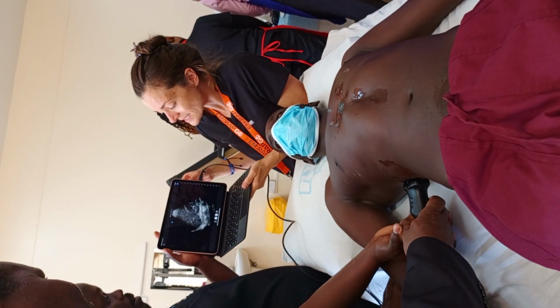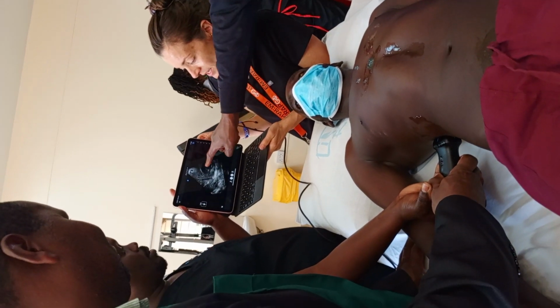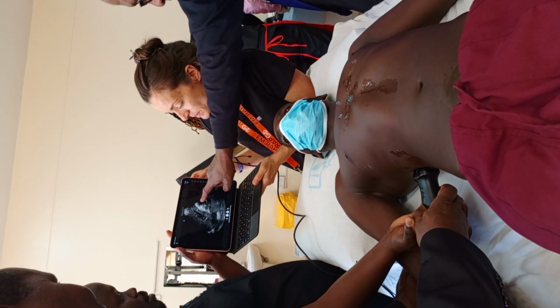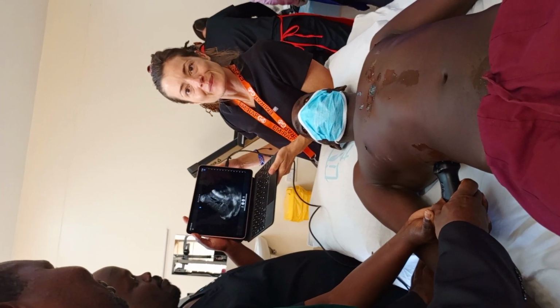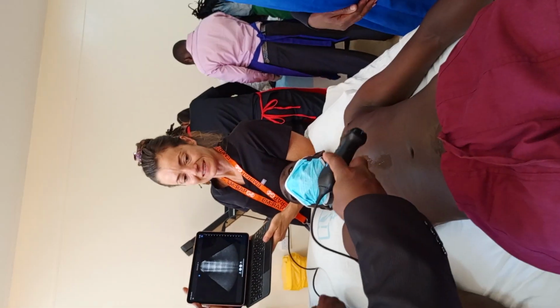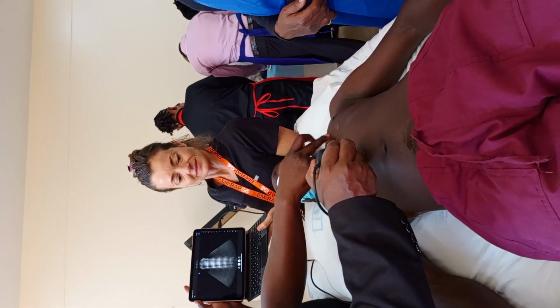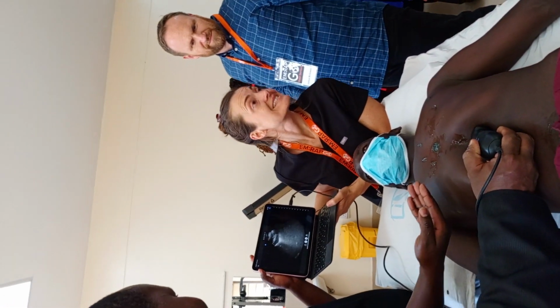Yep. Can you point to the liver? Yes. Can you point to the kidney? Can you point to Morrison's space? Yes. Beautiful. Amazing. Okay, let's do the subxiphoid. And I'm sorry, what's your name? Hamed? Nice to meet you.